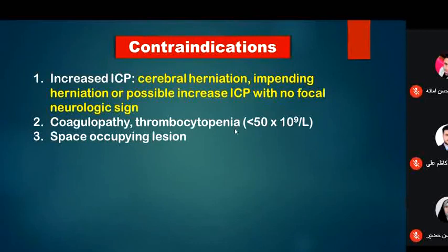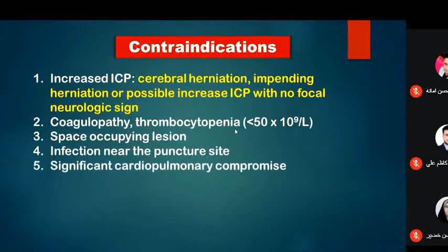And we fear cerebral herniation. Infection near the puncture site. On the skin, there should be no skin infection near the area. All the area should be sterilized. But if there is infection, we may introduce infection inside the CNS by doing the LP.